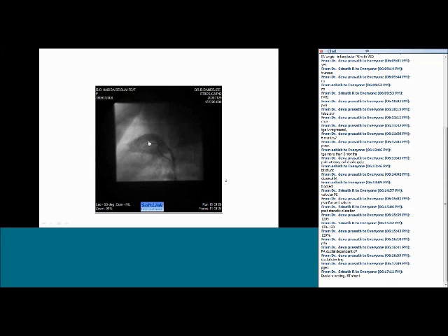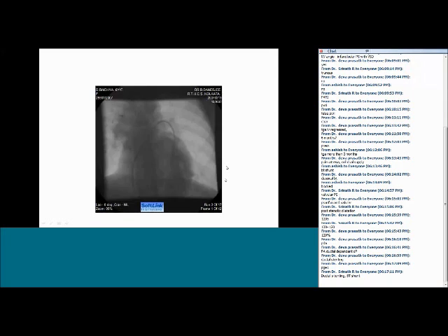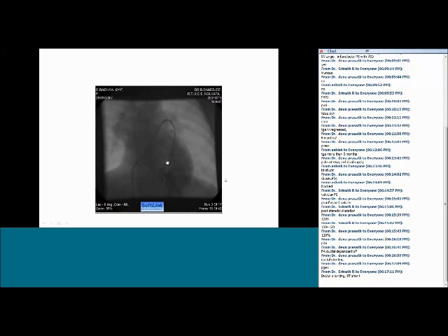Because when we put the first stent, the patient was initially alright, then suddenly the patient deteriorated. So we did an angio and found that the aortic end of the stent was slightly pinched off. So we again recrossed the stent and put another stent so that this side opens up. This patient has gone for his second stage repair. Okay, now what is the diagnosis in this patient? Quick diagnosis.